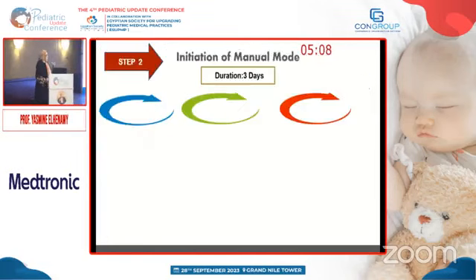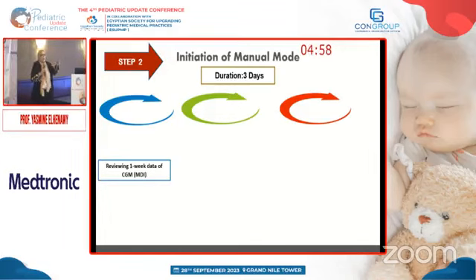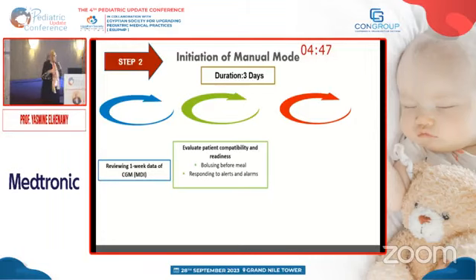طيب ستيب 2 بقى اللي هو انا ببدا البامب في المانيوال مود وذ سسبند بلو لو فيتشرز. زي ما قلنا ان احنا بنبدا بنركب سي جي ام من داي 1، فبيبقى عندي داتا بتاعت السي جي ام والجلوكوز باترنز والترندز والعيان على ام دي اي. By evaluating patient compatibility and readiness والبولسنج، بتاكد ان هو عارف to bolus امتى before the meal وبيرسبوند للالارمز والالرتس.